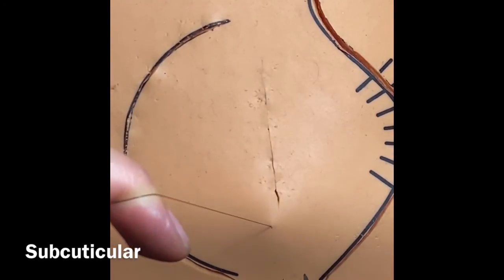This stitch you hold up and this is the only one that you don't cut on 45 degrees. You go all the way down the skin surface and just cut it flush and then it's gone. There's our subcuticular stitch.